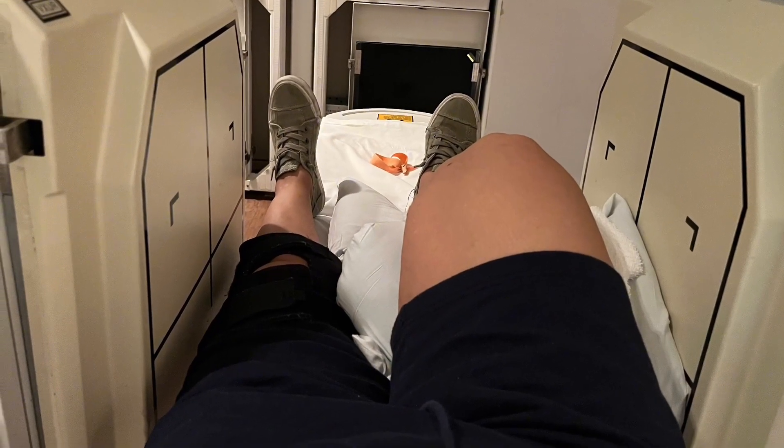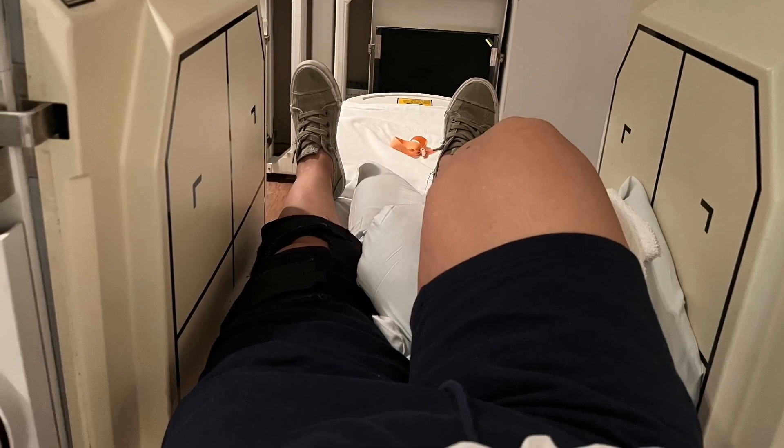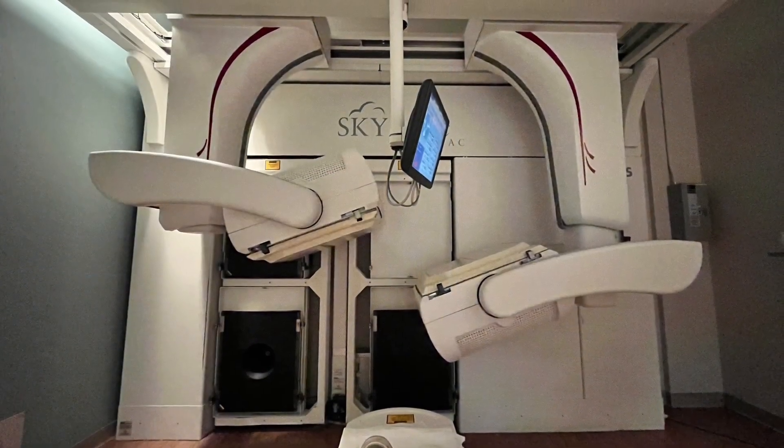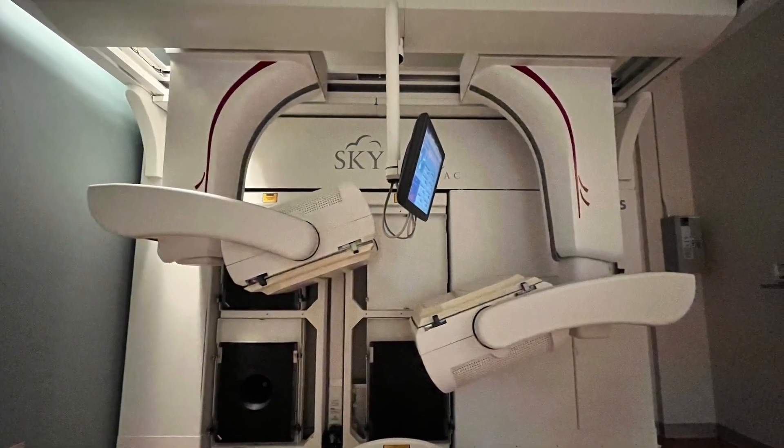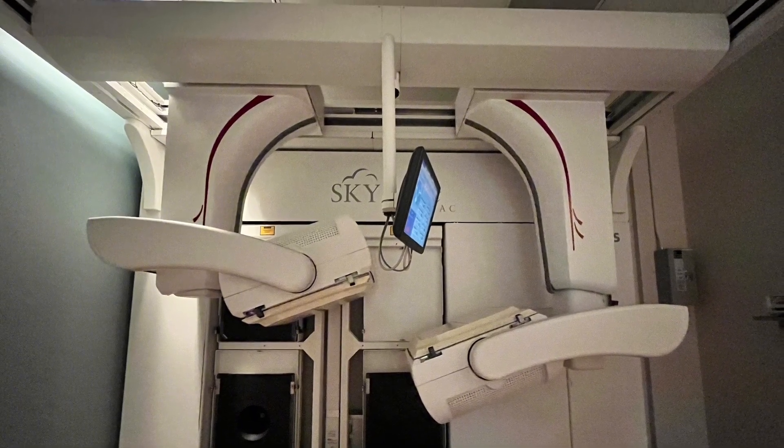See one leg, my left leg with my braces down because that's the injury leg and the other ones up. And then I try to capture how the, it looked on the scan in front of me, but that's the whole machine. When I was leaving, I took a picture. I'm sick. I'm sick. I'm sick. I can happen.